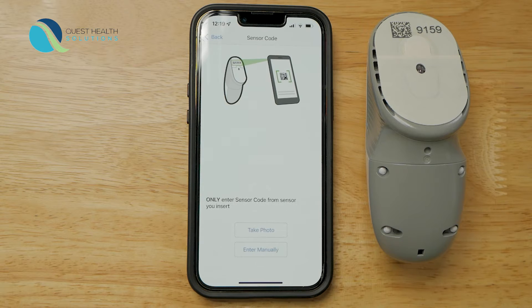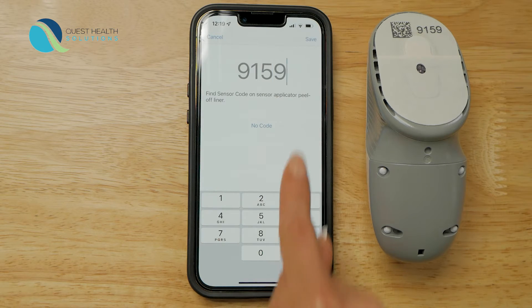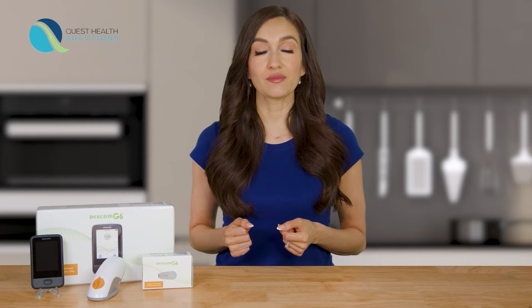Your sensor code is on the sensor applicator. Once you enter the code, press confirm and your sensor is now connected. The next few screens walk you through connecting your transmitter to your phone.